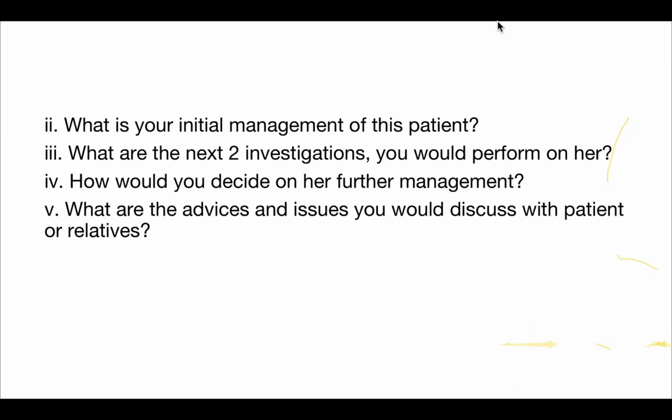But for any other rhythm, even though the blood pressure has dropped, let's say the blood pressure is 70/40, if you just give a defibrillation, you are not considering the place where the T wave is, QRS and T. So if you give the shock on top of that, the patient will go into a non-perfused rhythm, VF. So you are doing harm, right? So remember, as registrars or as medical officers, always do cardioversion if it is not pulseless VT or VF. Always cardioversion, unless you are doing more harm to the patient, right?